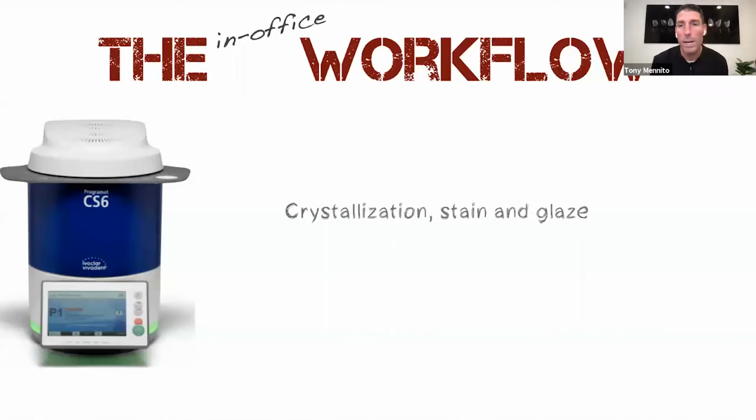All right, so let's talk about the in-office workflow for emax. You're going to prep your tooth, do your scan, do your design, and then mill it. Once you try it in the mouth, you're going to need to crystallize. If you want to stain and glaze, you do that in the same step. For emax with the new CS6 oven, that process only takes 11 minutes.